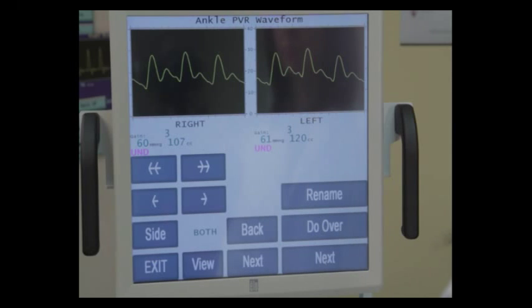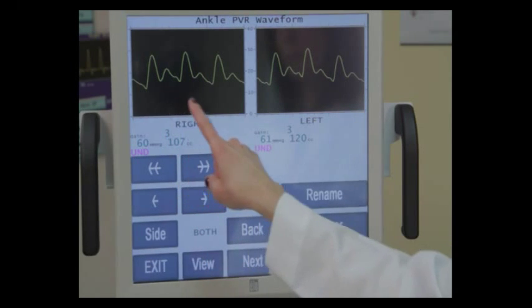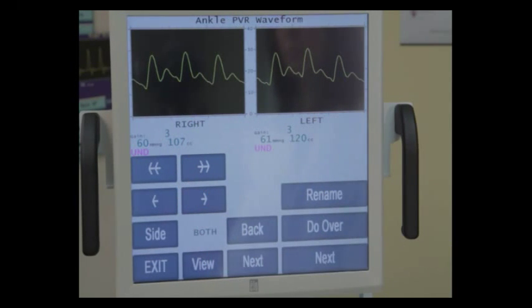The goal of taking a good PVR wave tracing is you want to capture about 3 consecutive waveforms of equal size. A lot of patients will present with cardiac issues, and you'll have events like missed beats or double beats, and you do not want to capture those, as those are outliers and not representative of the patient's natural state. So when you see three waveforms in a row that are consistent, you can capture.